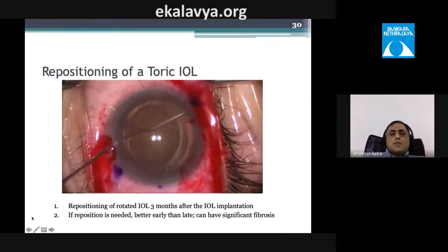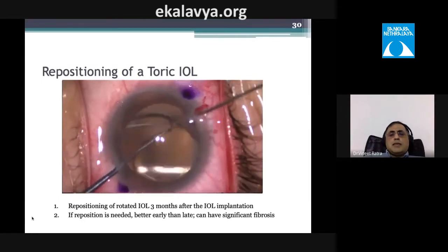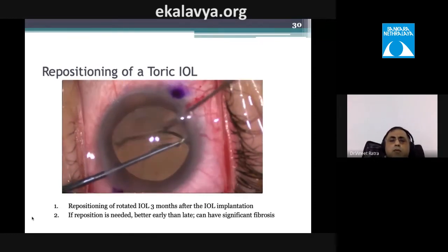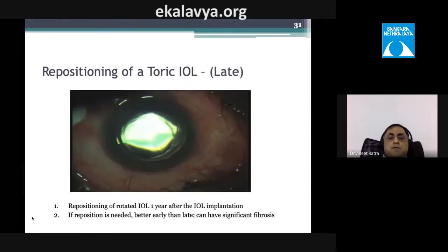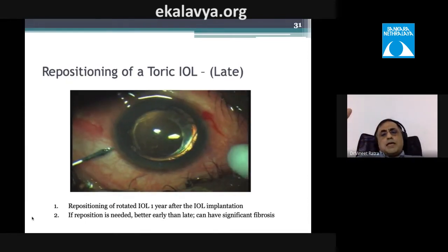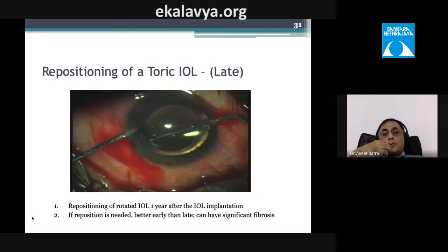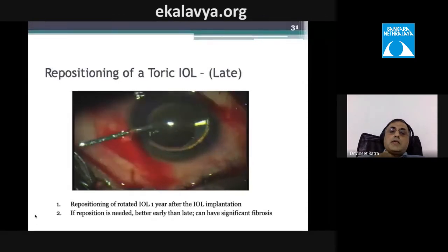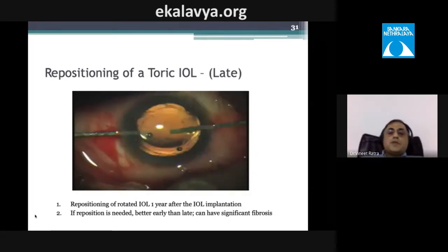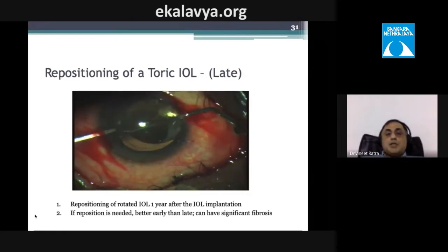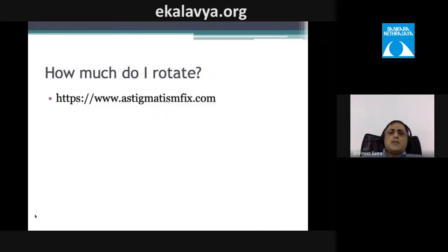When repositioning a toric IOL, first separate the capsular bag and loosen any adhesions before rotating the lens. Even a lens rotated nearly one year post-surgery can be corrected — in one patient, rotating the lens by approximately 10 degrees corrected astigmatism from 3 diopters to zero. Use a second instrument to release the haptic edges before rotating.